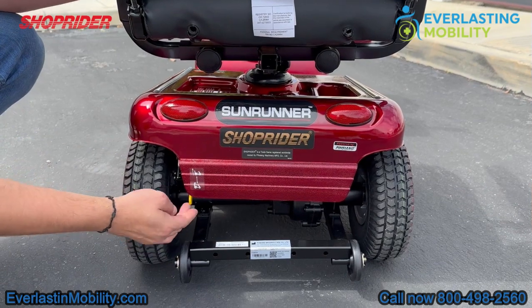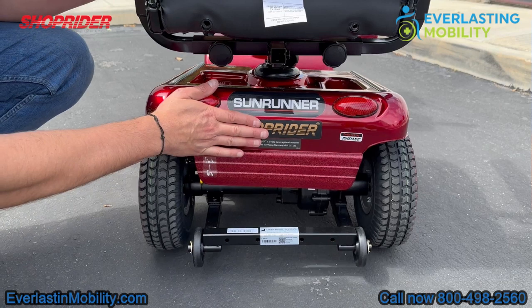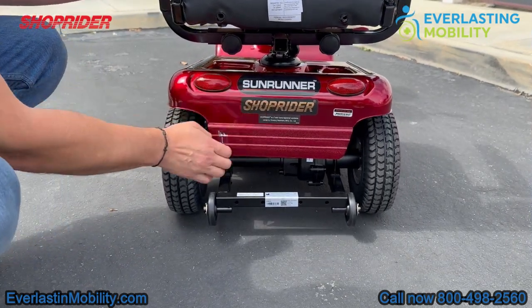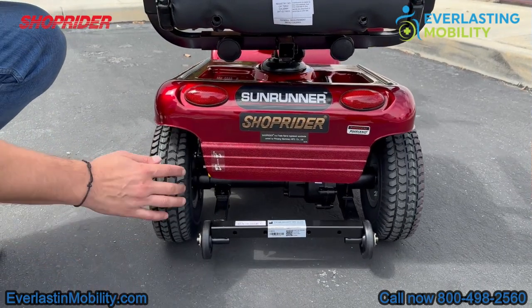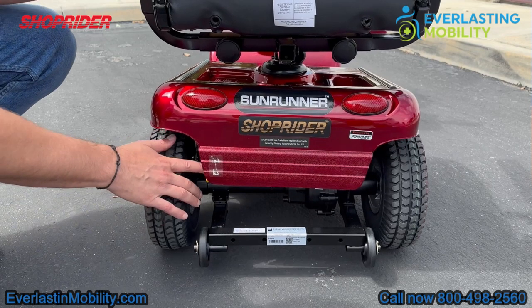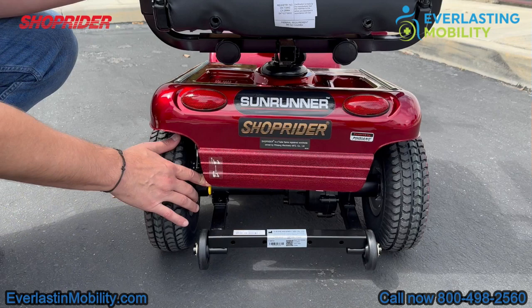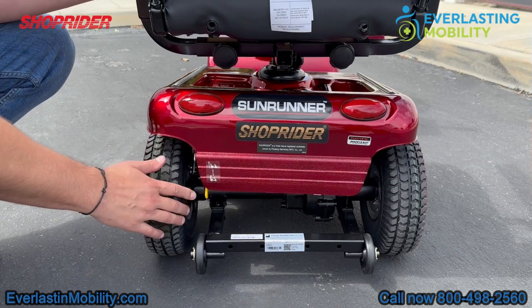This yellow lever is the freewheel lever. If you press it up, that puts the scooter into neutral so you can push it manually — useful if you run out of battery life. If it's pressed down in the drive position, you can't push the scooter. In order to operate and drive the scooter, the freewheel lever must be pressed down into the drive position.